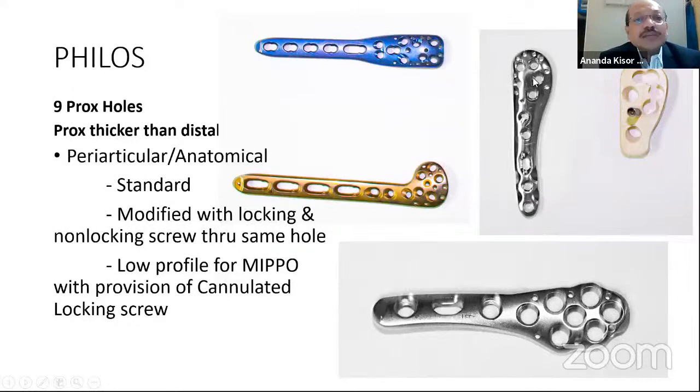Basically, the cannulated locking screw can be inserted, and for this, there are some jigs. These jigs are attached over there. Through the jigs, there are some sleeves, and through the sleeves, the guide wires can be used. So what is the utility of this cannulated locking screw? Cannulated locking screw causes the exact, precise placement of the locking screw, that reduces the wobbling factor and that reduces the temperature development. Once you introduce it, if it is not properly matched in the screw threads, that causes much more tissue damage, bone damage inside the humeral head. So that can be avoided.